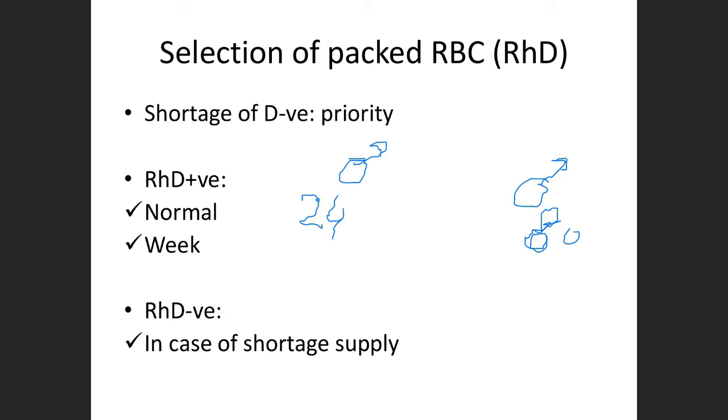Both of them are again B negative, and you will have only one B negative blood. Which one of them has priority to have the B negative and why? Shahd and Aisha chose 24, which is the correct answer.